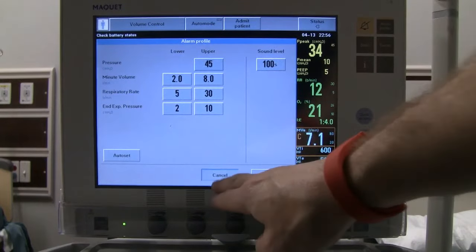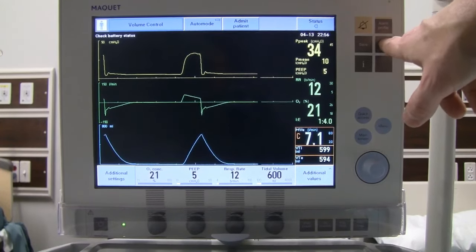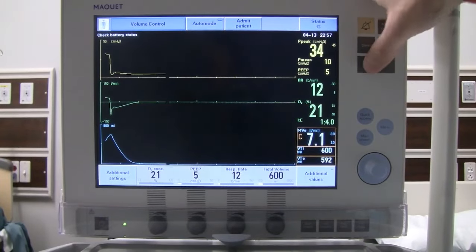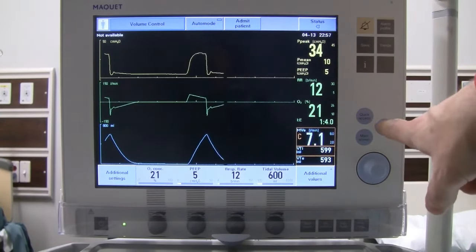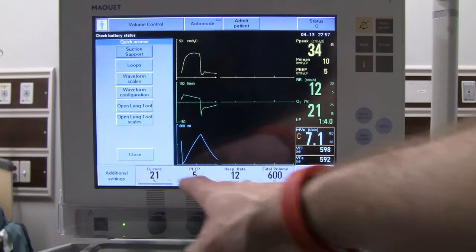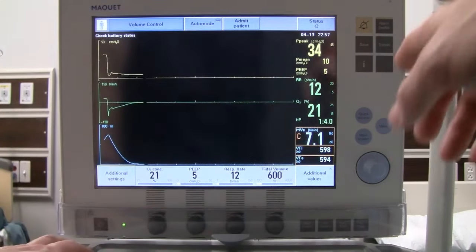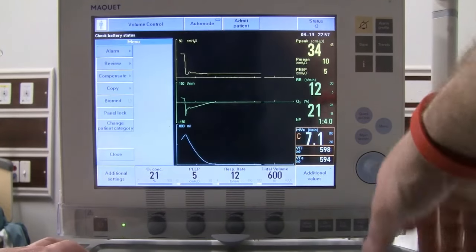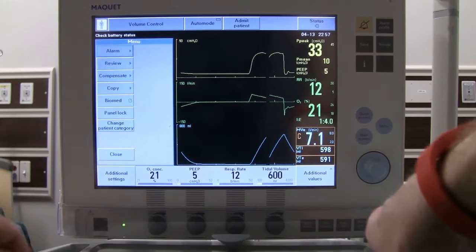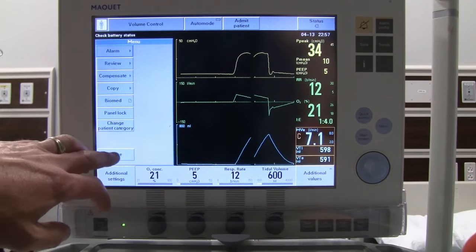Up at the top right we have alarm silence and alarm profile for the alarm screen. We have a save button for saving screen data, trends going back up to 24 hours, and an info button for specific information. There are quick access buttons for different loops, waveforms, and tools built into the ventilator, as well as a full menu for adjusting alarms and other details.